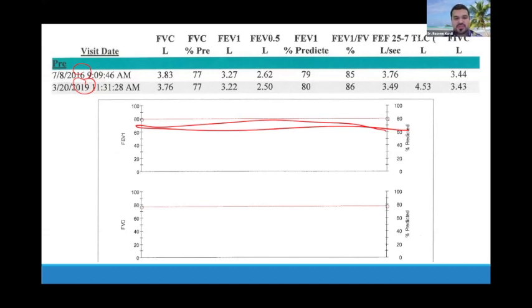The highest FEV1 percent that I've seen was 137 for an Olympic swimmer, actually. So you can be supranormal because as I said, 100% is based on your average. But there are people who are beyond average, who have larger lung volumes. So you can actually be at 101%, 120%, 137%, the highest that I've seen. So you need to make sure that you're following the pattern and how did that change.